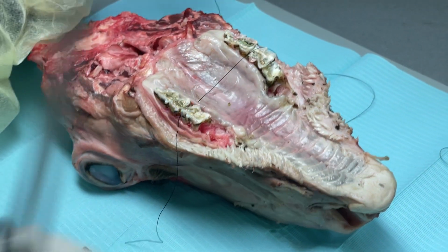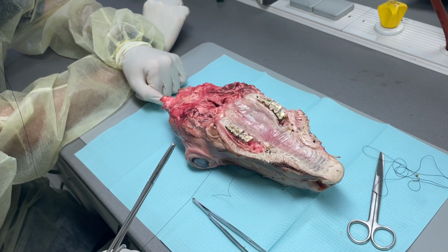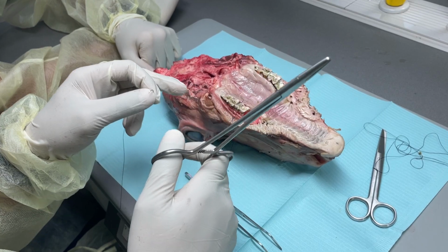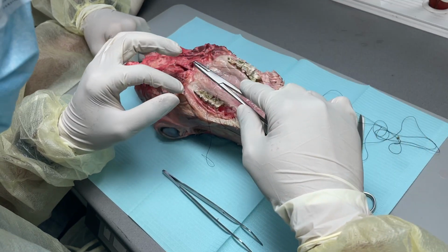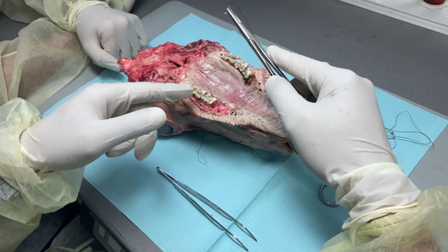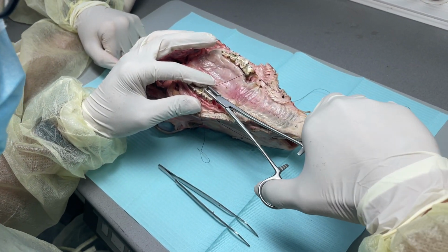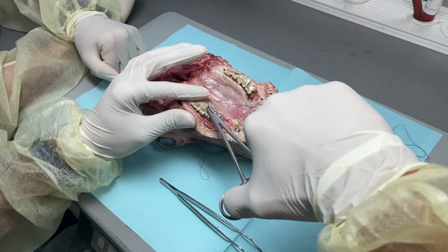The most important thing: for tying the knot you need to bring this across. In the patient's teeth it is easy; if you put one instrument and move it, it will pass interdentally. There will be some spacing, you can easily bring it. In this case, we will pass it under the contact point, because from the surface I cannot bring it interdentally.